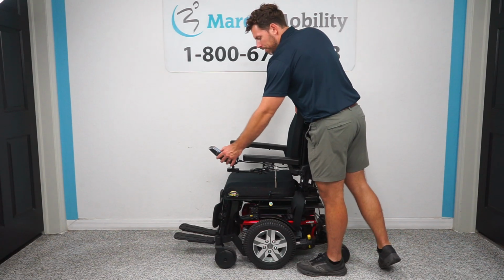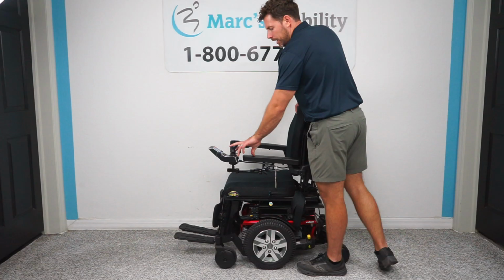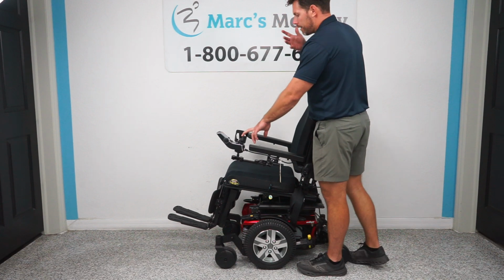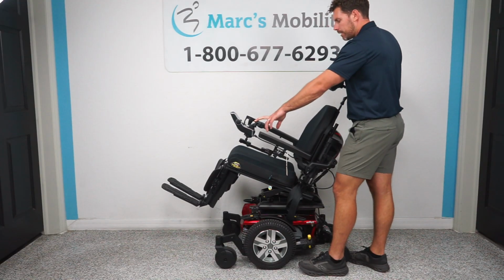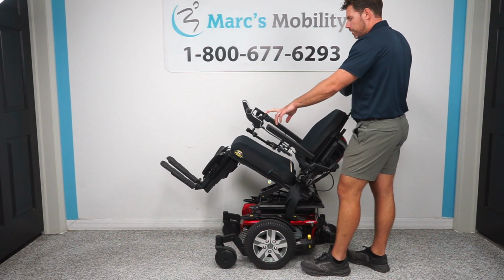Now you do everything through the joystick by pushing the left tab forward on this Q-Logic 3 electronics. And the first function I'm going to show you is going to be the electric tilt. Now what you're going to do is you're going to go where the back and bottom are highlighted. That's going to be your tilt. If you just did the back, it's just going to be recline, or just your legs, that's just going to be your legs. Now what this is here is the electric tilt.